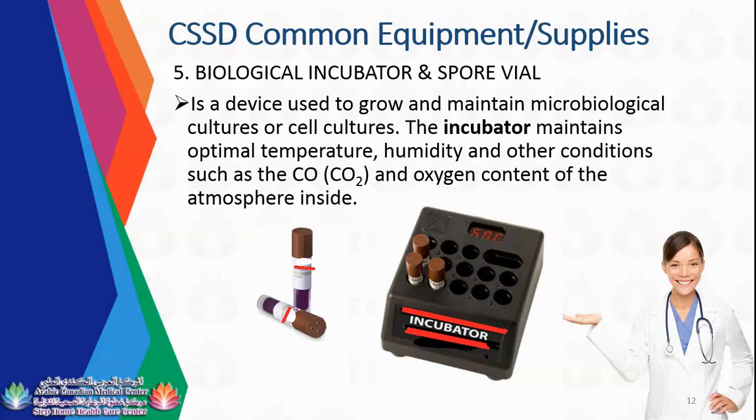Actually, guys, as you can see on your left side, your biological indicator, the purple is just your incubating solution. The bacteria is on the bottom part, which is impregnated in a small filter paper. So if you can see it here, there's a small filter paper at the bottom of that vial.